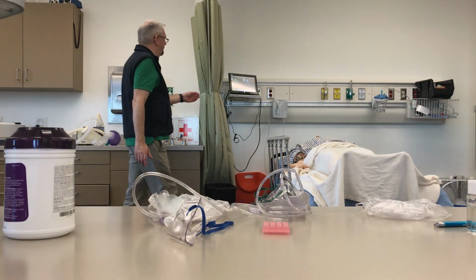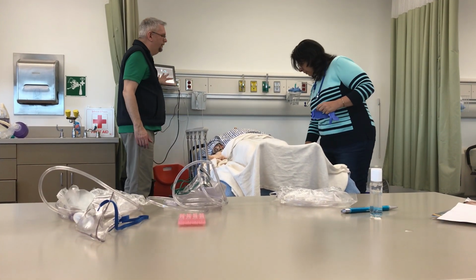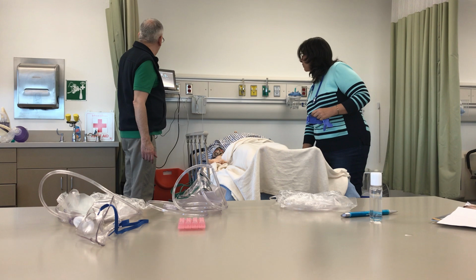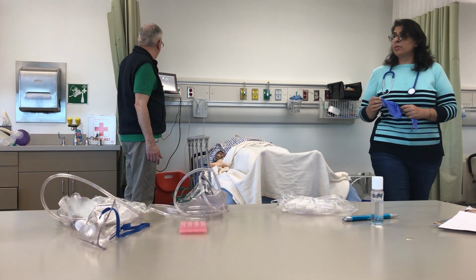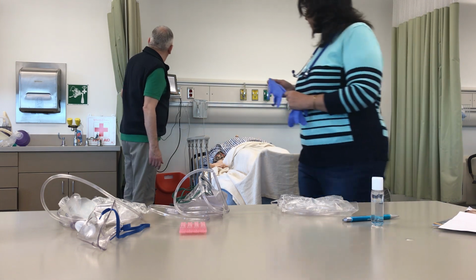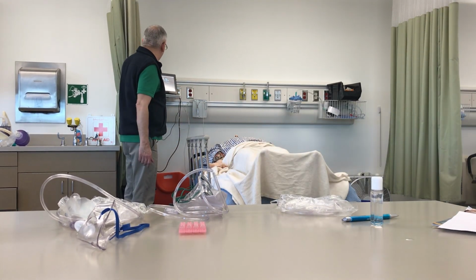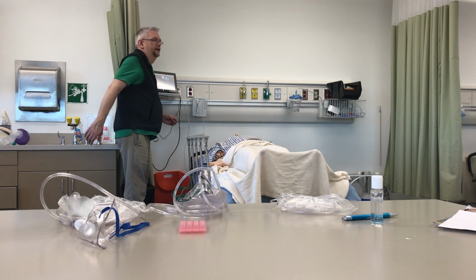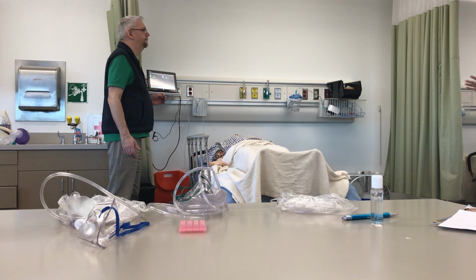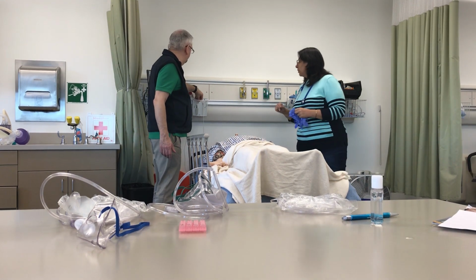A couple of things about the monitor. In order to see things when you start, you're going to have to touch the heart rate to get the heart rate to come up. We attach the cuff, we touch this, and then there'll be a start button that'll cycle the blood pressure. Do we have a pulse ox probe? The pulse ox probe is here, and it will give you data once you put it on.